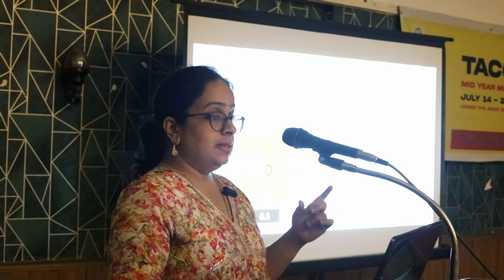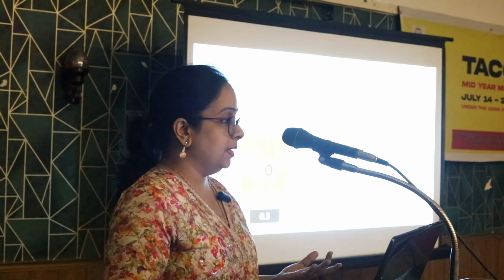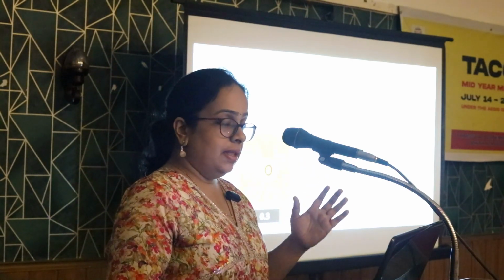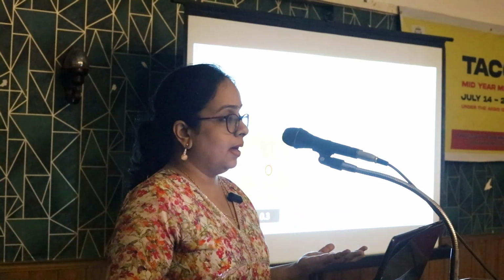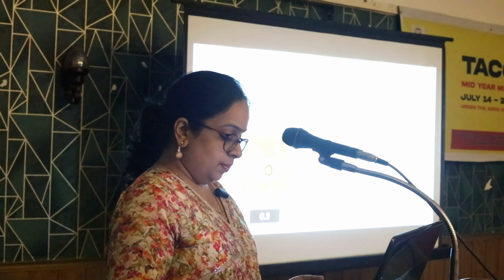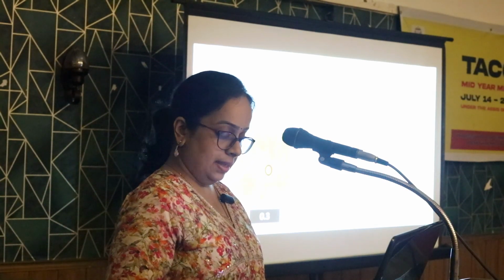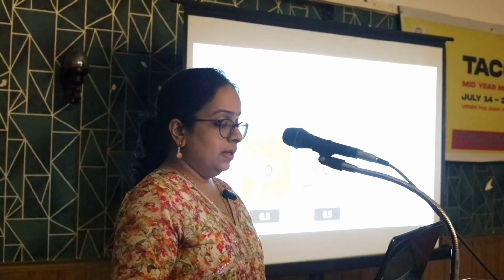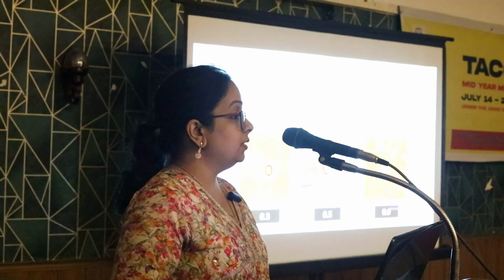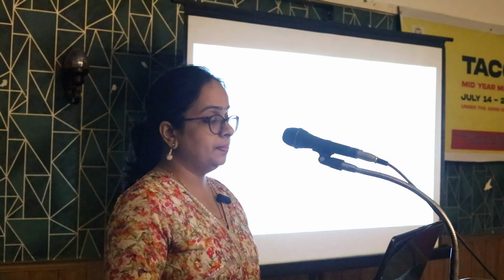CD ratio is something we use for screening. It is a very sensitive entity, but it may not be specific. Even if you see a larger CD ratio in a person with a normal neuroretinal rim, they may not have glaucoma. Similarly, in this case, the person has a smaller CD ratio of 0.3, but there is loss of retinal nerve fiber layer. In this case there is 0.5 cupping but there is an RNFL defect, and obviously in the case of a 0.9. So whatever the CD ratio, there is a chance of having glaucoma.